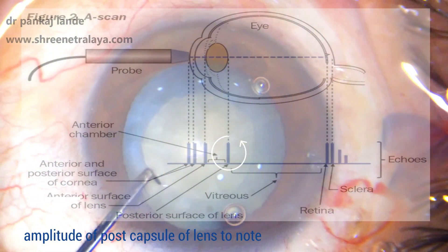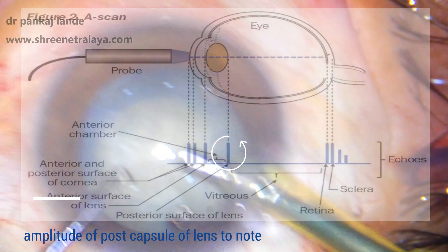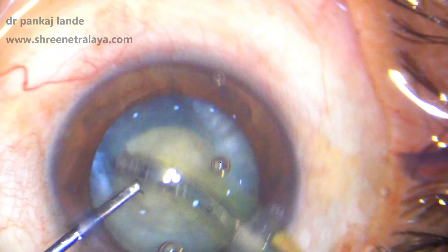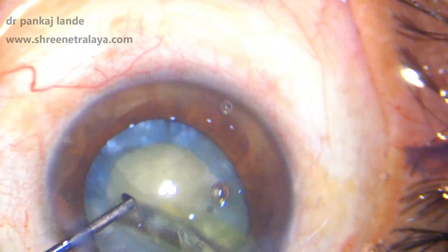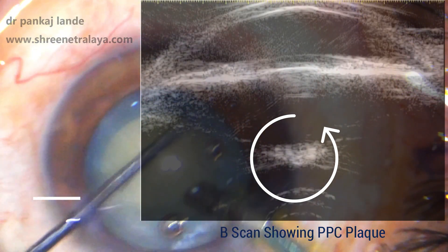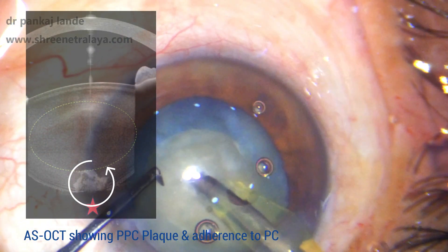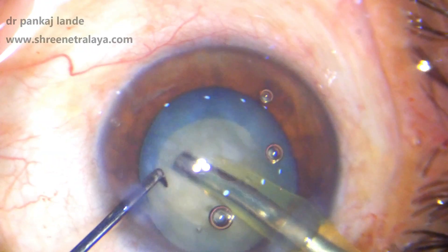My trick to identify posterior polar cataracts in a mature cataract is to look at the amplitude scan of an A-scan. The height of the amplitude scan at the posterior capsule plane will give you a fair idea about posterior polar cataracts — it will be more in cases of a posterior polar plaque. This A-scan is an important tool to identify posterior polar cataract in mature cataract, as well as opacity in immature posterior polar cataracts.